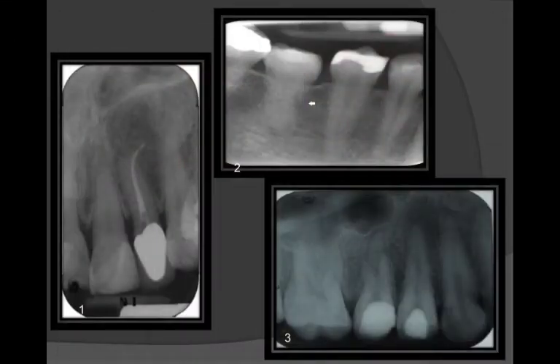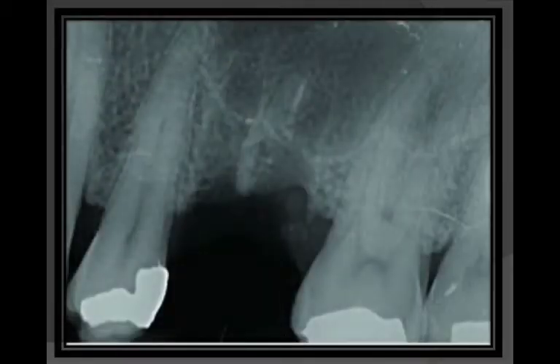Periapical radiograph for pre-extraction planning and for development anomalies. Here in the first image we have dilaceration. Here periapical radiograph for ankylosis. And here for root morphology, in the second premolar we have 3 roots. Here periapical radiograph for a foreign body after extraction. Here we have a root after extraction.